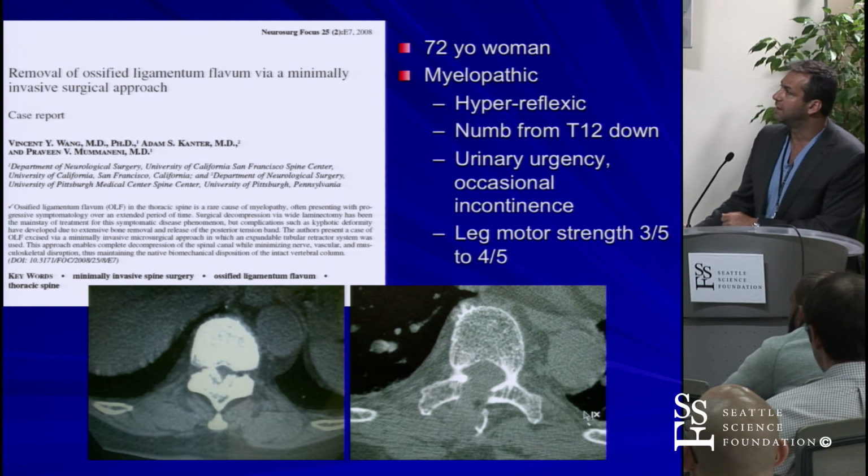Here's another one, again, removal of ossified ligamentum flavum, again, not disc herniation, but similar approach. But you can see, obviously, this was more posterior pathology, and it was removed posteriorly, but we did get a publication out of that, right, Praveen?